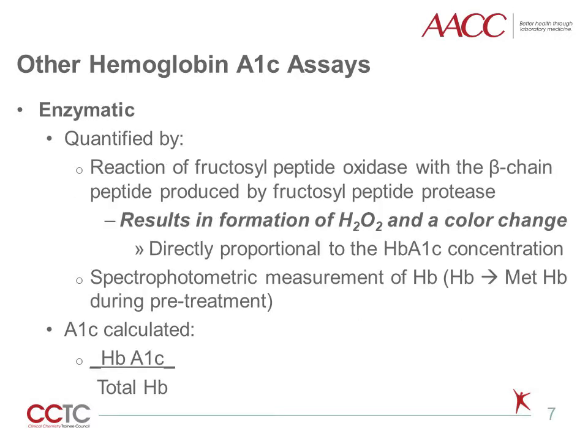2018. A third alternative method to quantify hemoglobin A1c is through an enzymatic process. The premise behind the Abbott system is to quantify the hemoglobin and hemoglobin A1c separately and then to take a ratio, in a similar fashion to the measurement procedure of the immunoassay methods.